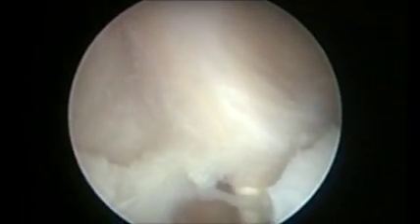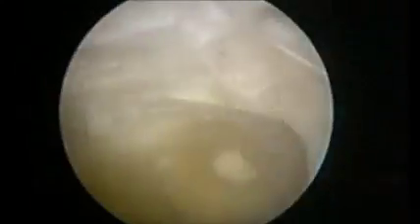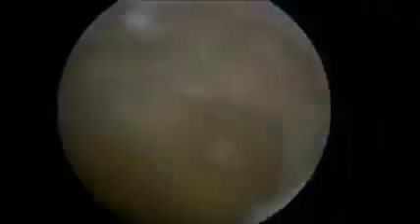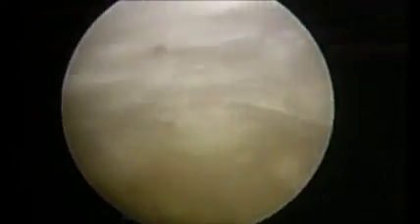Once the opening is large enough, one can enter into the popliteal cyst directly and inspect the septi and the cyst wall. In case one finds there are multiloculated or multilobulated cysts, the septi can be divided by using a cystic portal directly, although that is not very often required.